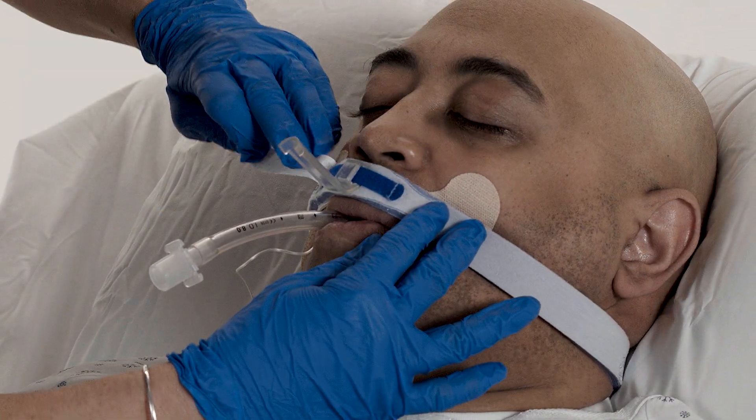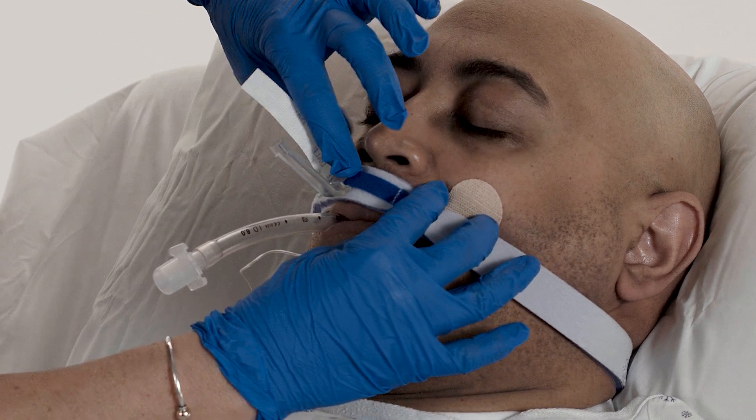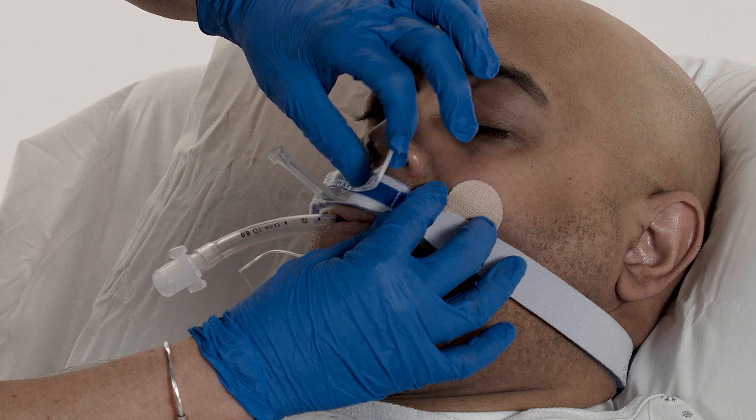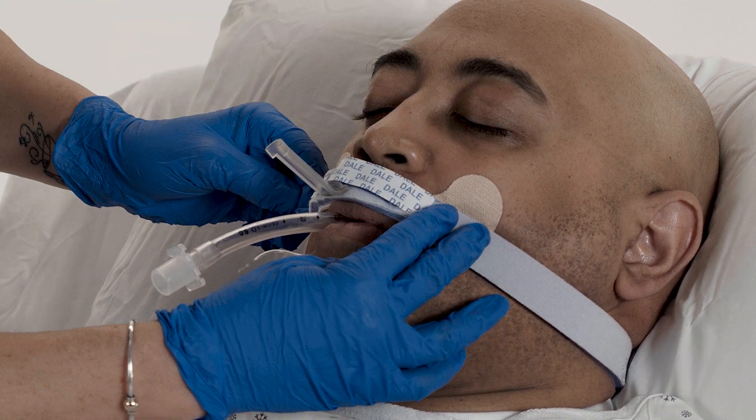Lift the Dale Overlay. Position the channel over the ET tube. Press the Dale Overlay across the track and neckband to secure the position of the endotracheal tube.